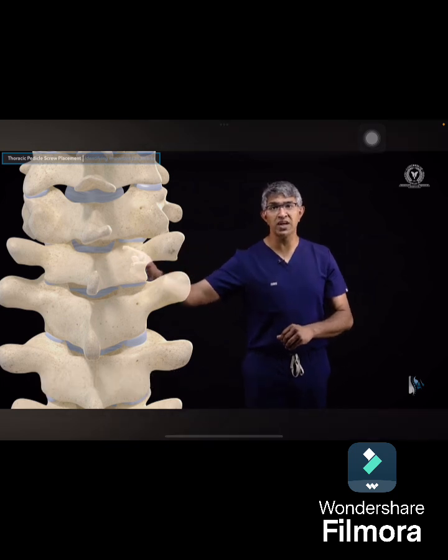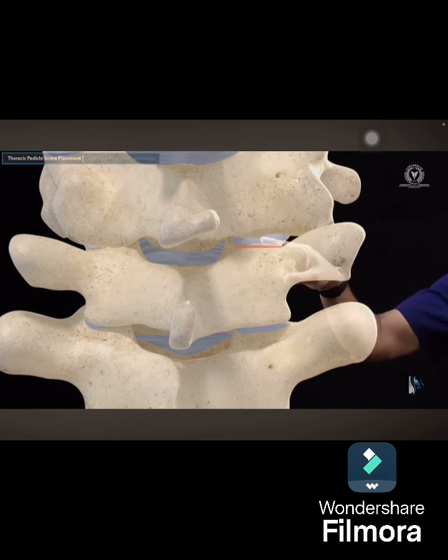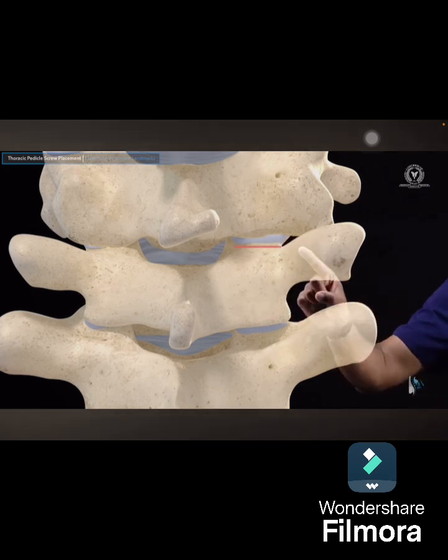One of the important landmarks is looking at the joint. So here you can see the width of the joint here. This is the superior articular process that's kind of just out of view. It's tucked in behind the inferior articular process there. But you have a sense of what the width of the joint itself looks like.